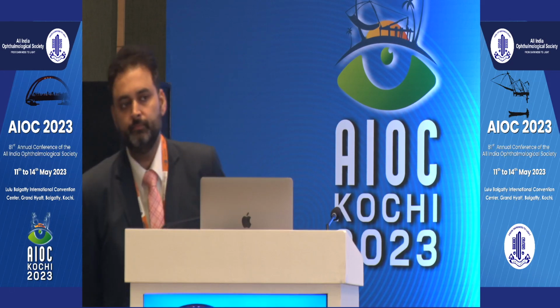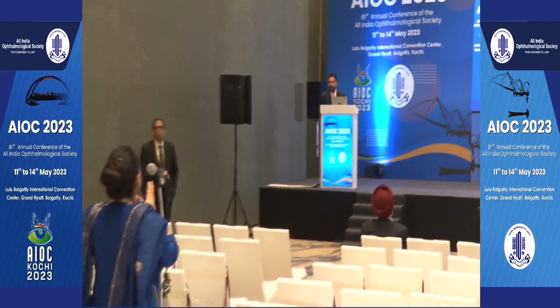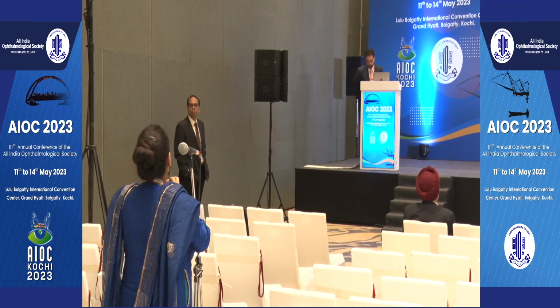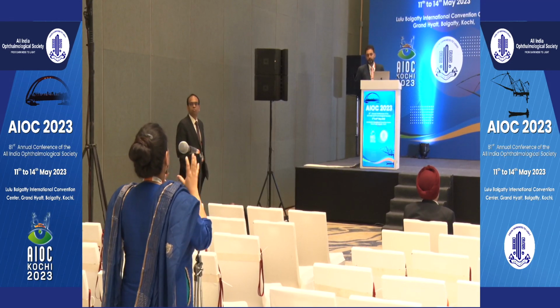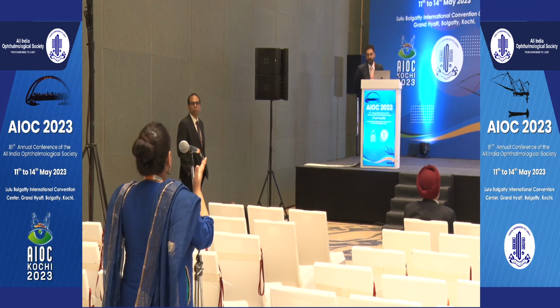I think in the first case, I did not think of PST. He was monocular, and I think when I was operating, the vitreous hemorrhage was very, very dense. The yellow chicken fat kind of a thing. And of course, there was a peripheral skirt where you cannot do base shaving. And of course, there was thorough laser.